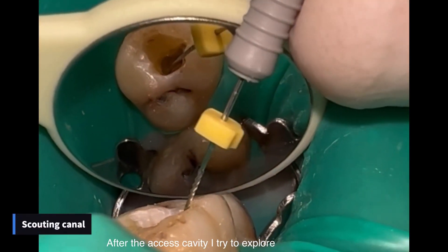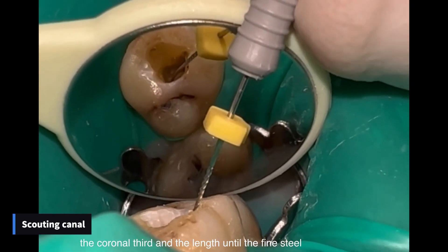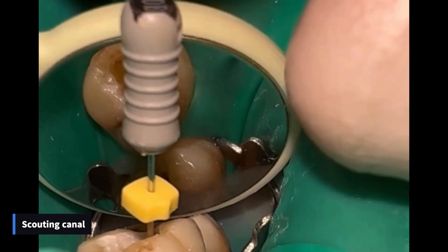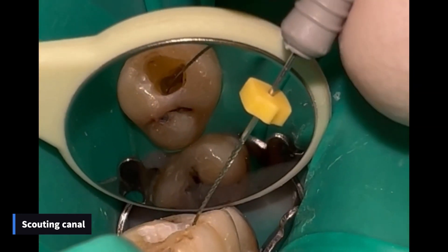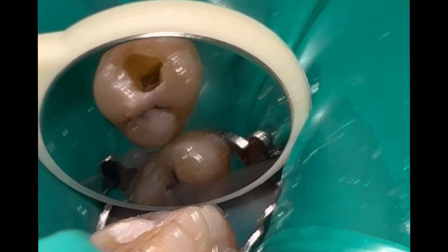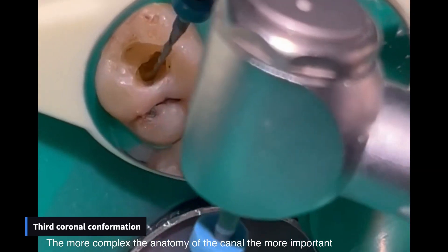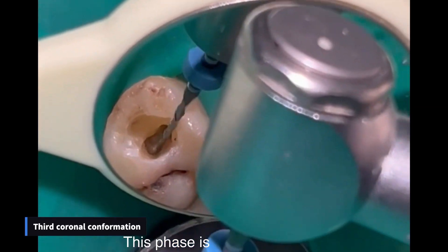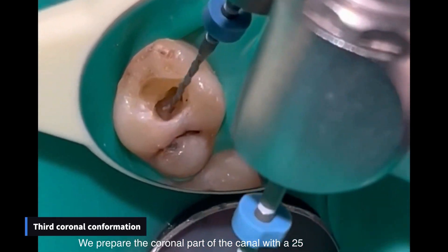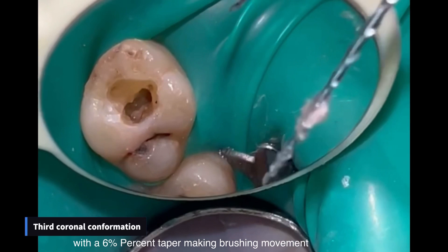After the access cavity, I try to explore the coronal third and the length until the fine steel file can advance freely. The more complex the anatomy of the canal, the more important this phase is. We prepare the coronal part of the canal with a 20 file with a 6% taper, making brushing movements.